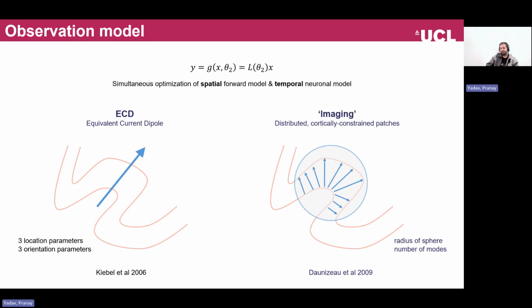Now, these both are for EEG and MEG. If we have already localized our data in source space, we can proceed with a virtual electrode or an LFP approach. Alternatively, we could directly have LFP measurements, in which case the observation model is a scalar gain function.